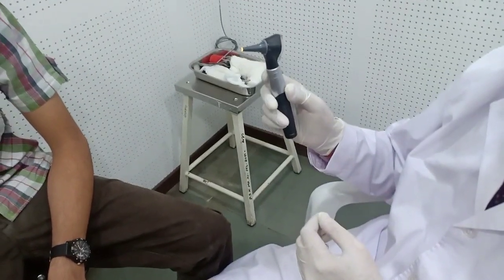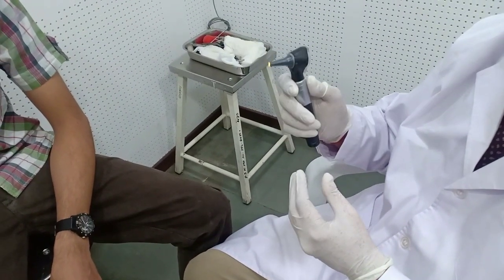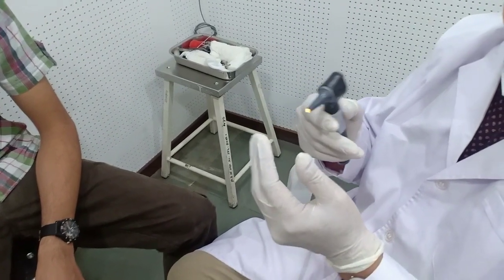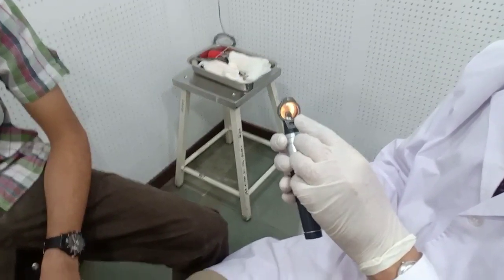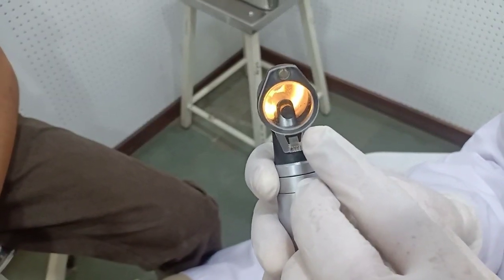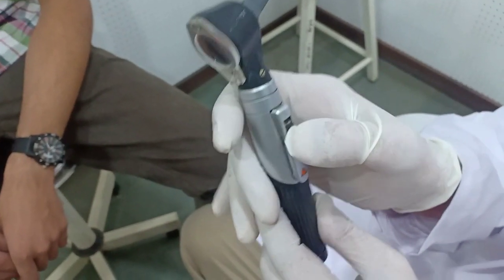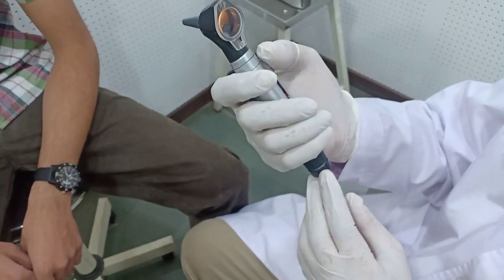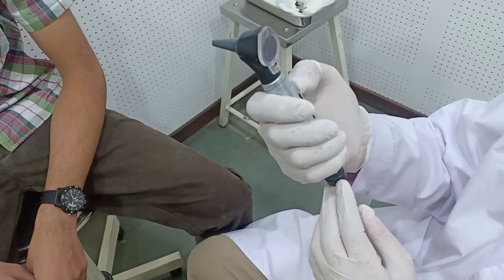If you are examining the left ear, you will have to hold it in your left hand. If you are examining the right, then we hold it in the right hand. You can see the bright light, and this lens provides magnification, about 2.5 times. These are the on and off switches, and this handle has the battery power. So inbuilt power and inbuilt light are there, which makes the examination very smooth.